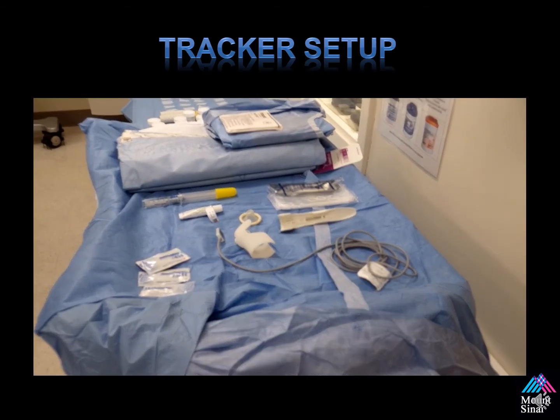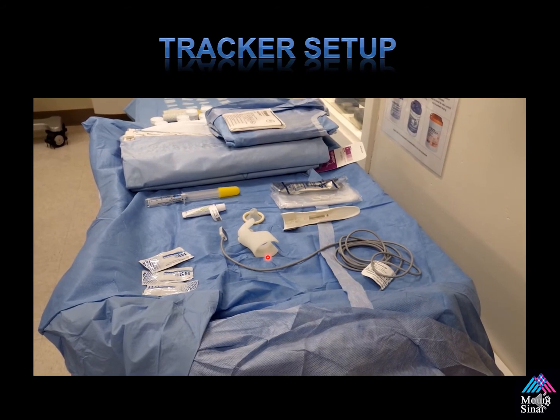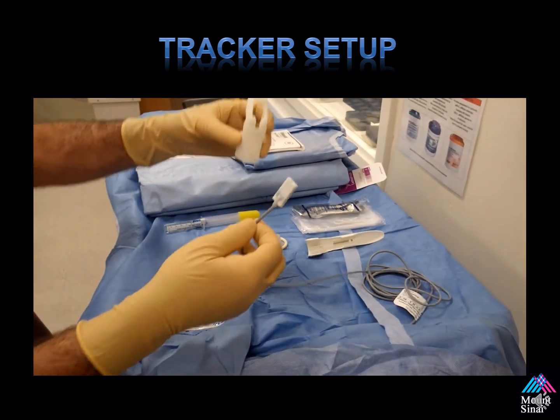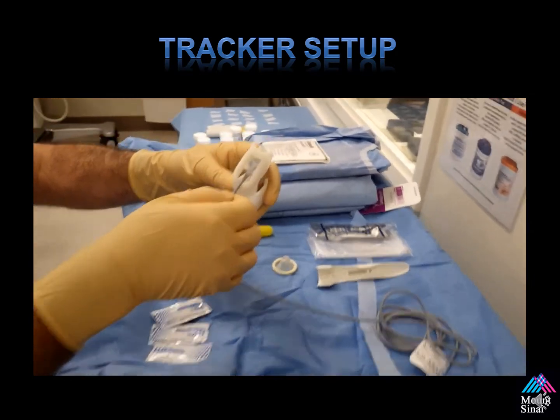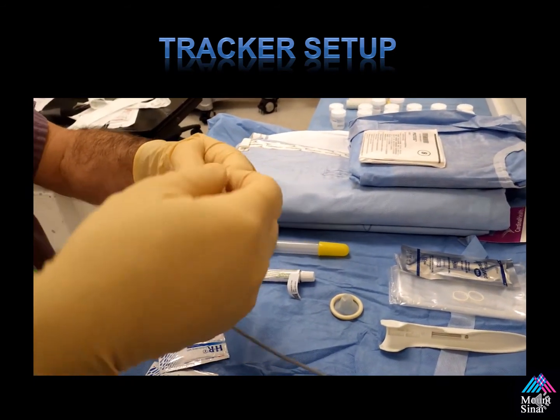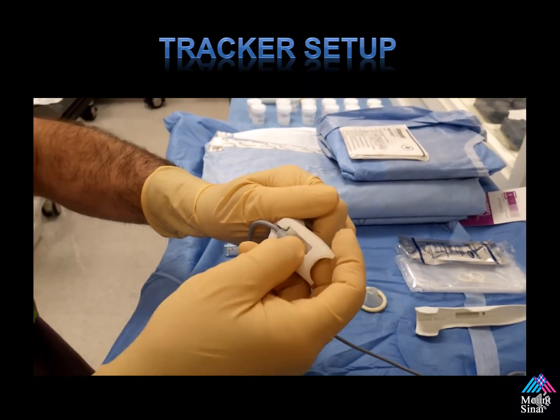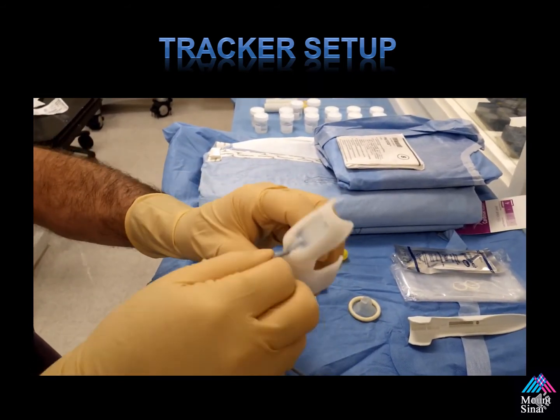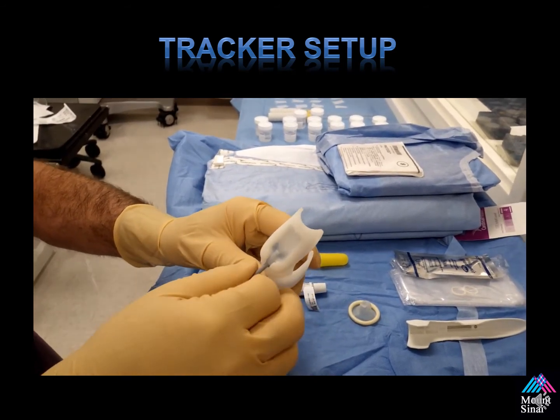This is an example of the tracker setup. We have our needle guide, our clip, and our GPS tracker. What's really important is when you seat these devices together, there should be an audible click when you put the tracker in. Each ultrasound hub has its own unique tracker setup, but they're all pretty much the same. The important thing is the audible click — this must be stable and not movable at all, because this is how your probe is tracked.